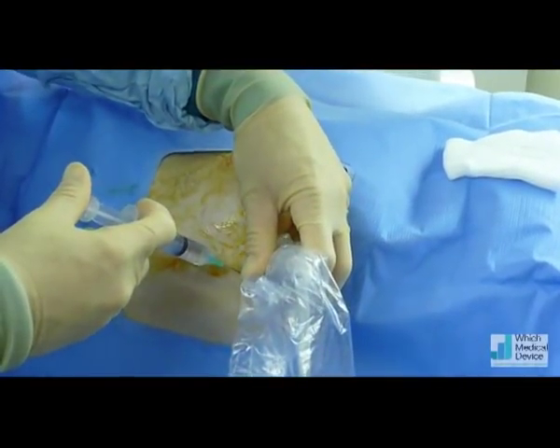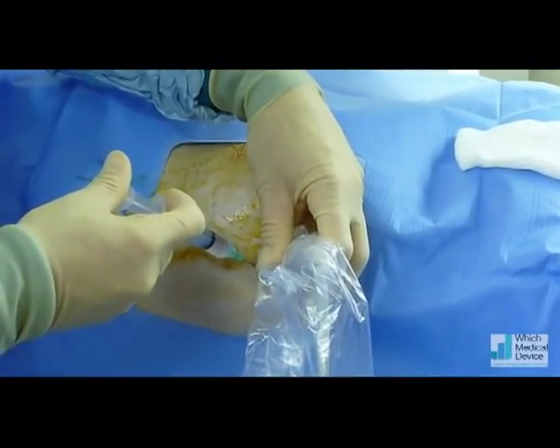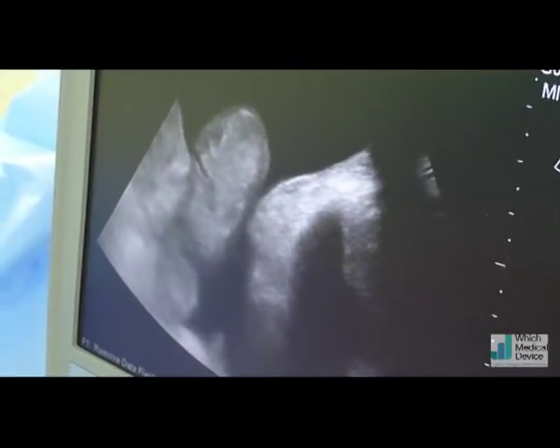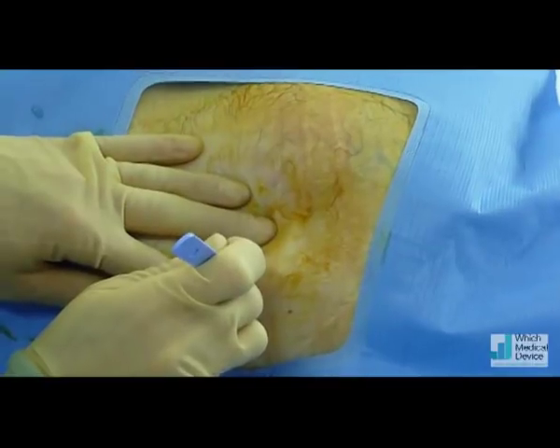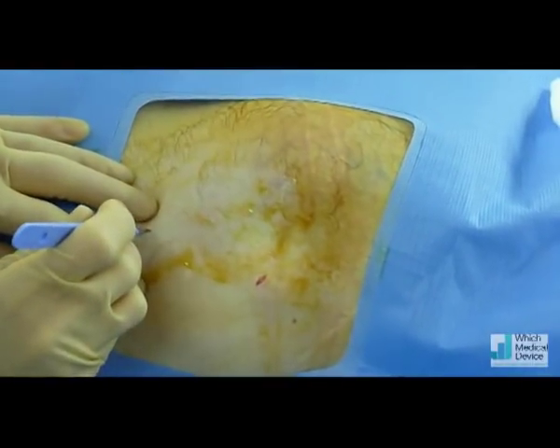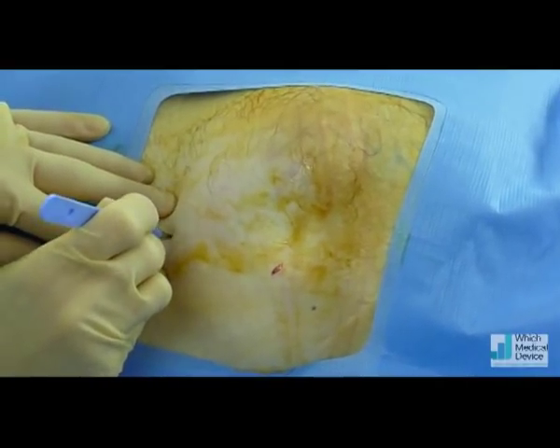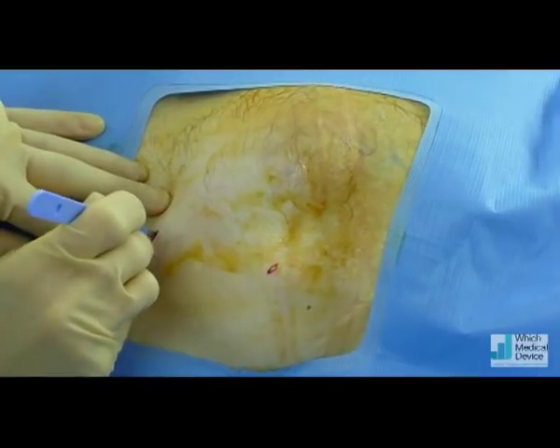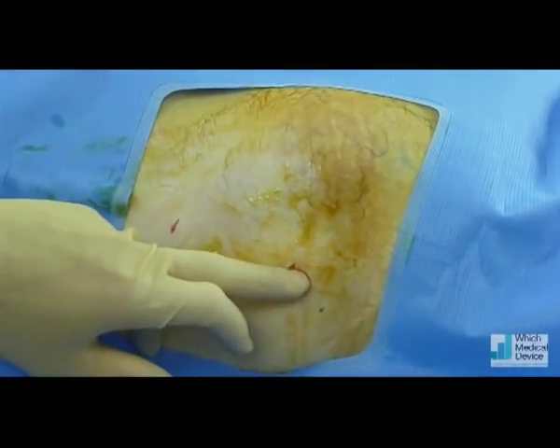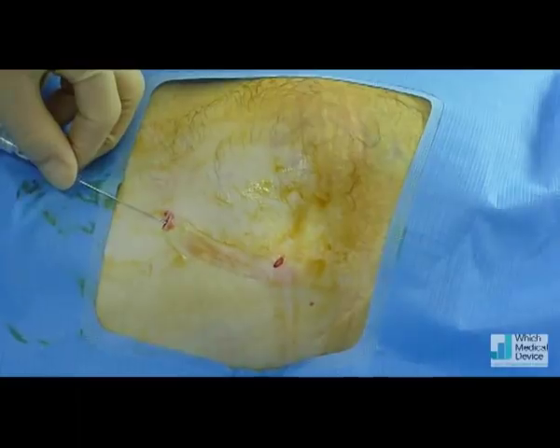Bit more anaesthetic now. This local anaesthetic is going to go right through to the peritoneum — a needle right the way through. That's the peritoneal entry site; the catheter will be tunneled this way and out through the skin here. We're just going to anaesthetise the tract using a spinal needle.